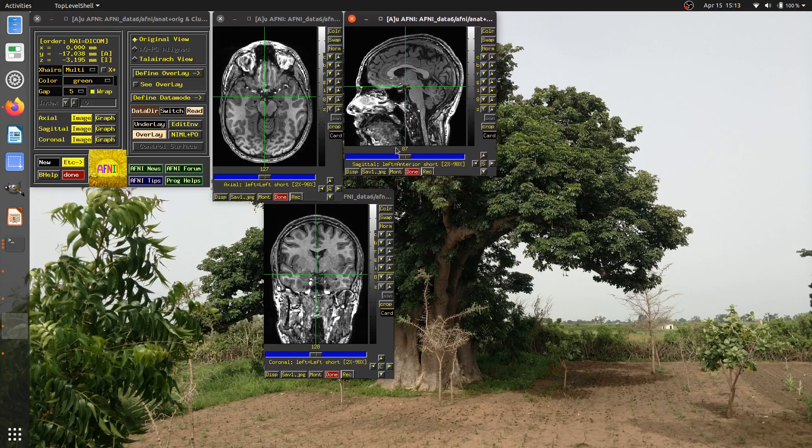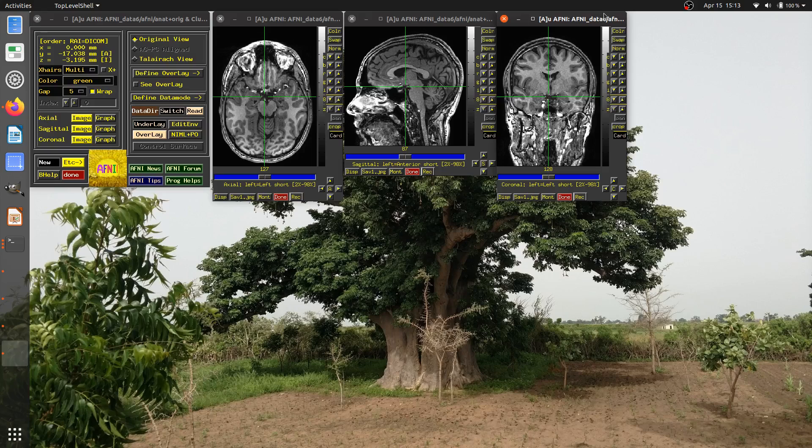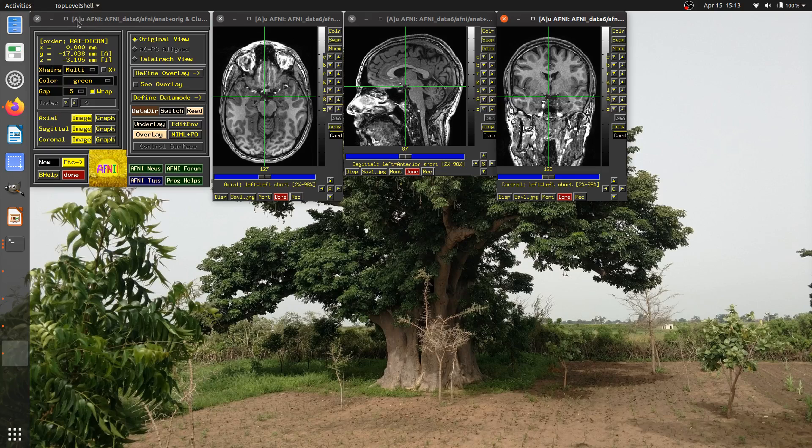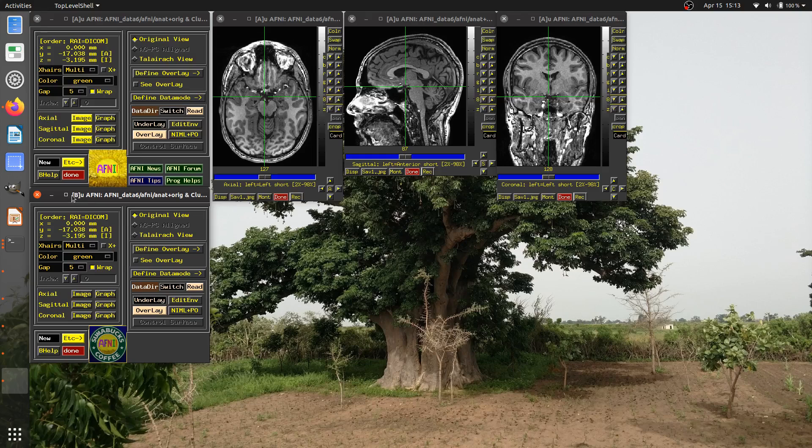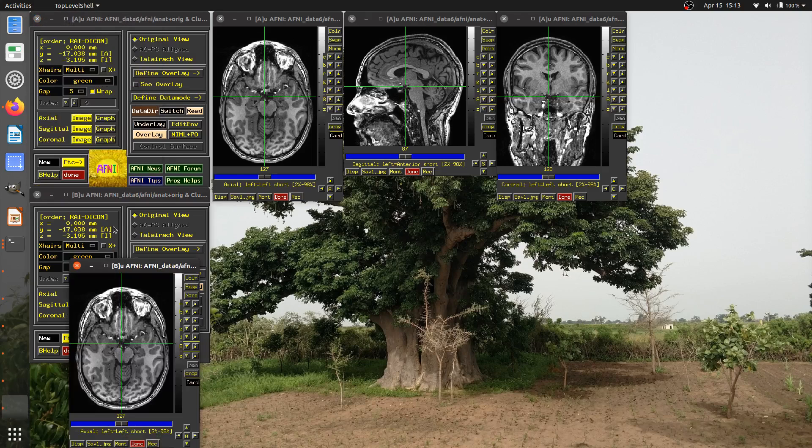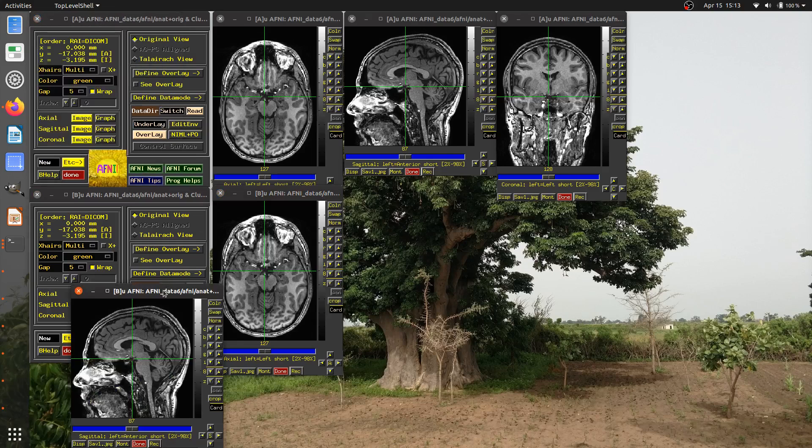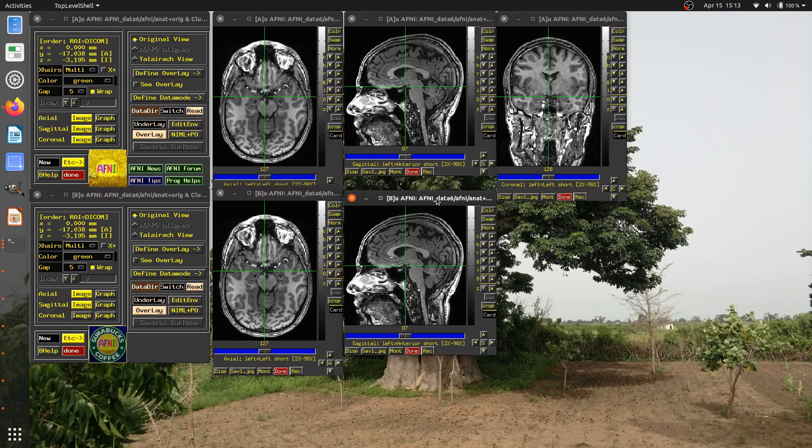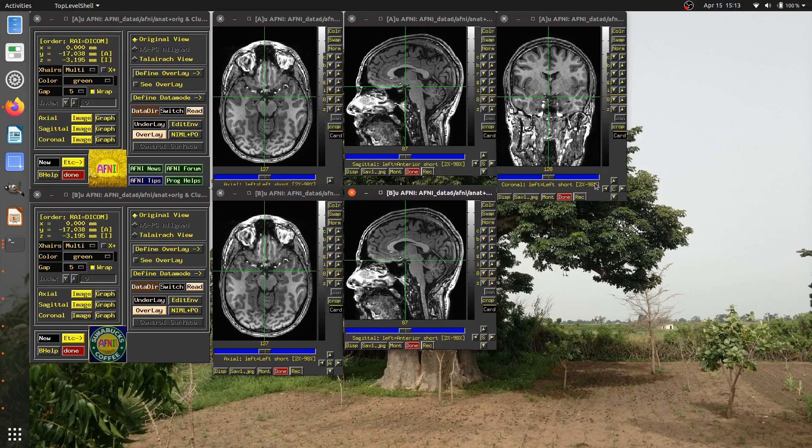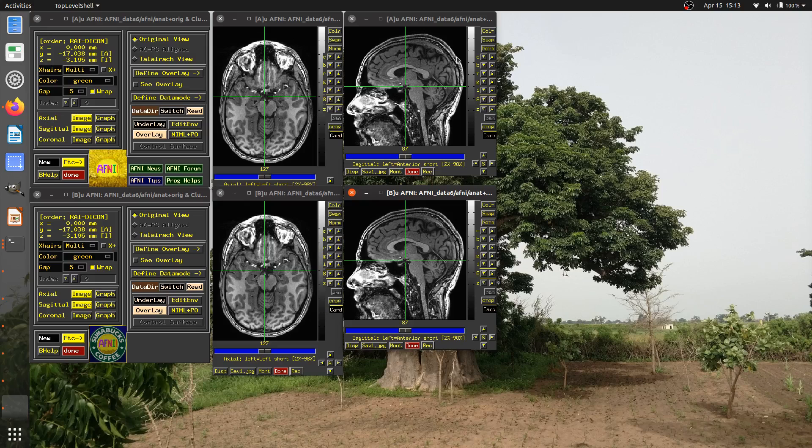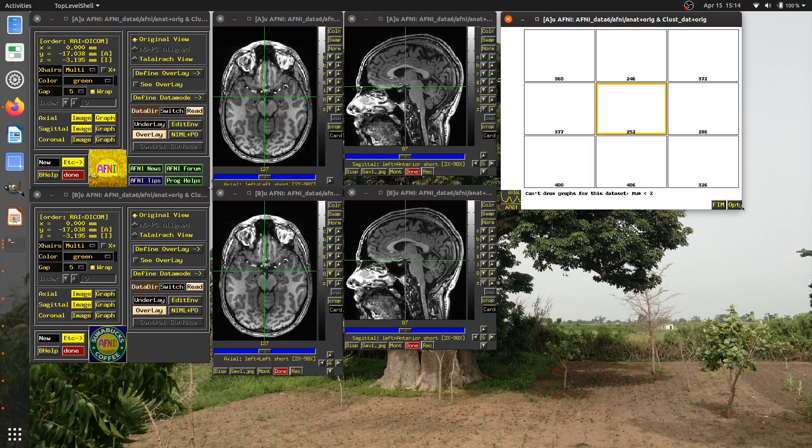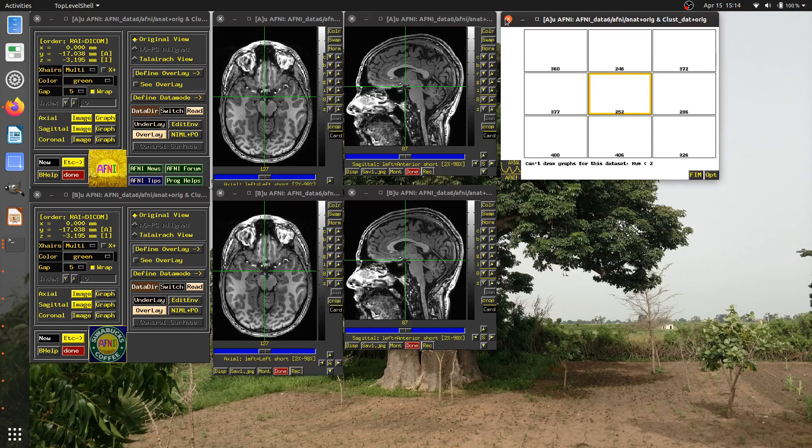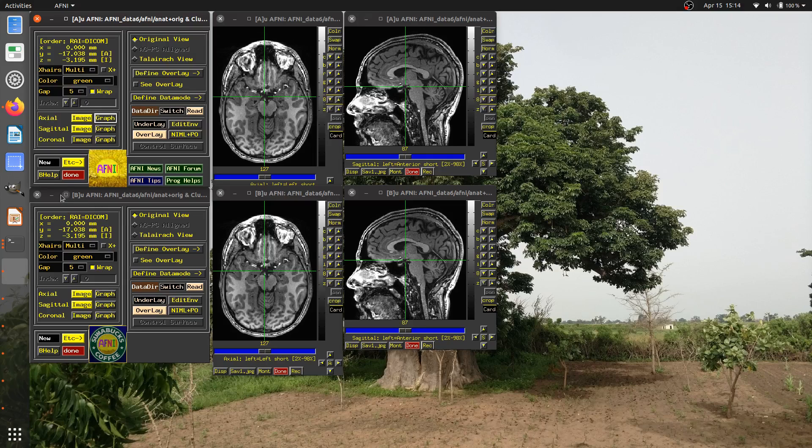And here I open up my controller, and I have these control panels. And one thing that you can notice now that you may not have noticed before, but in the title bar of each one of these is a letter in square brackets, A, A, A, A. Why is that? Well, if I go to this button, New, and open up a new controller, you'll see that this one has a B, and every new image that I open up for it has a B in it.